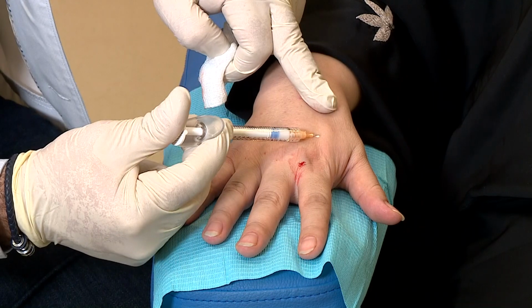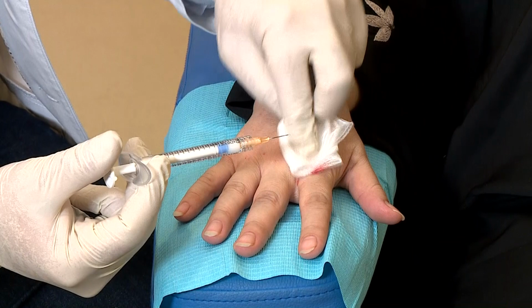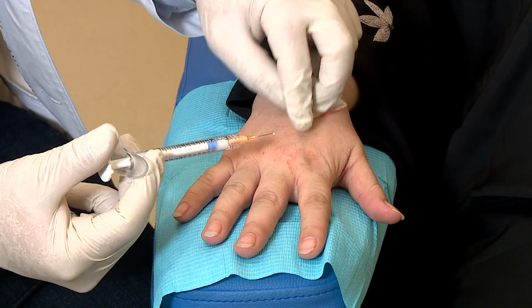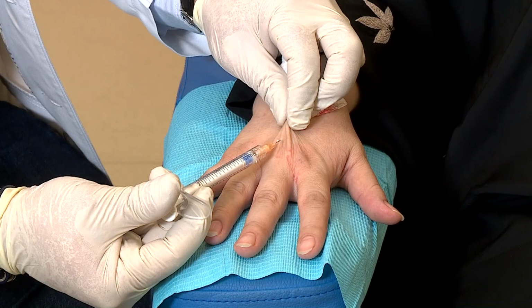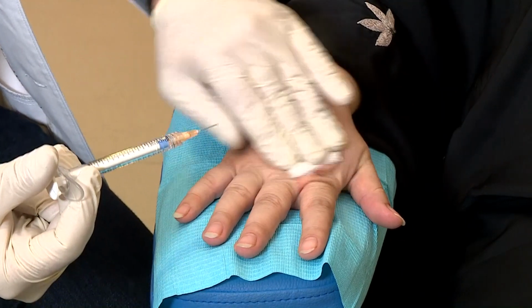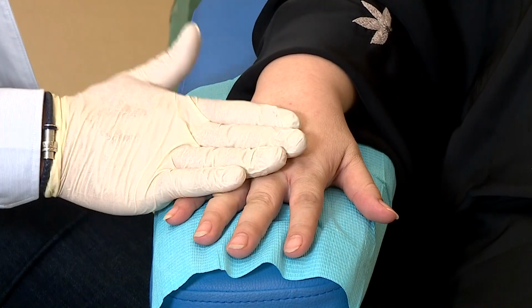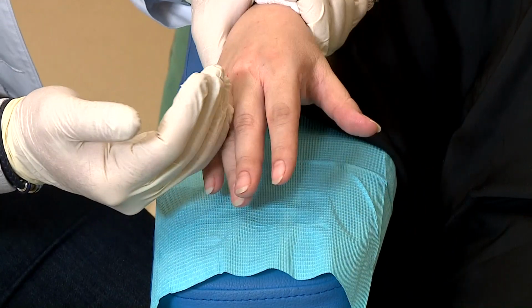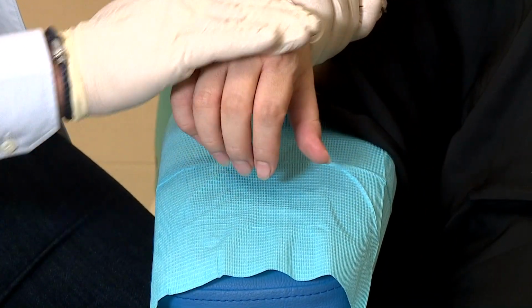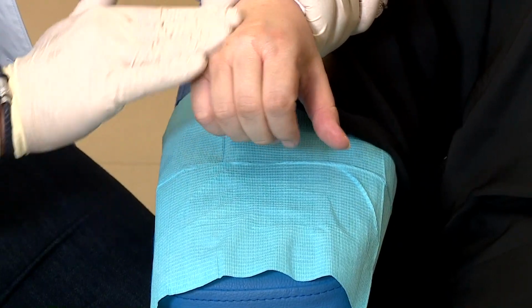The only product that is officially labeled to be used for hand rejuvenation is Radius, although there are many other products that have been used lately for the hands, but this is the officially approved product to use for the hands. As we can see, we have injected, and it's an easy technique to do, but it's just a little bit more risk of bruises to the blood vessel.